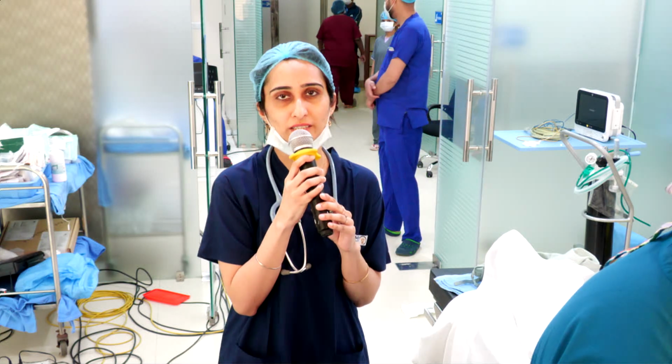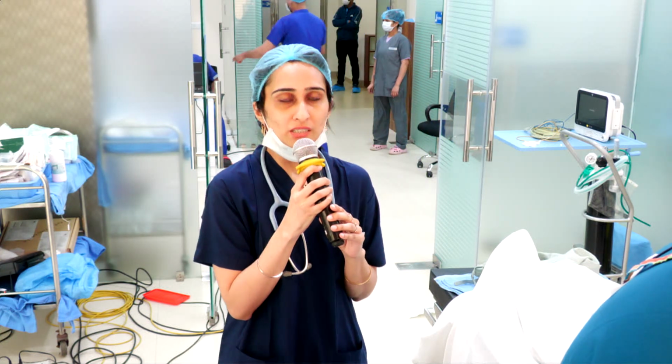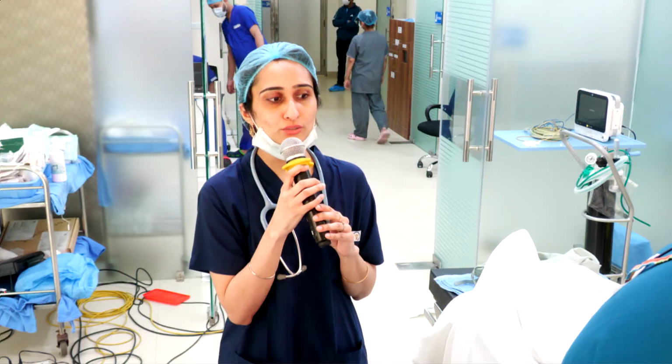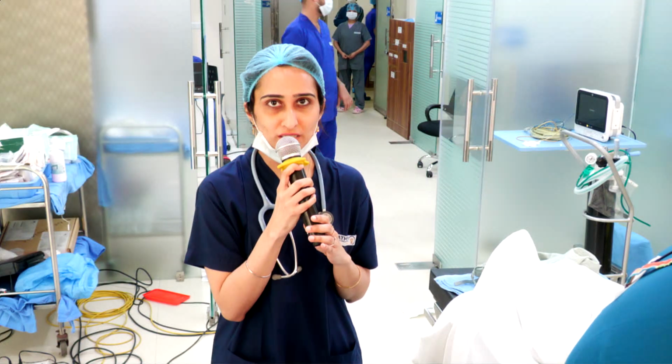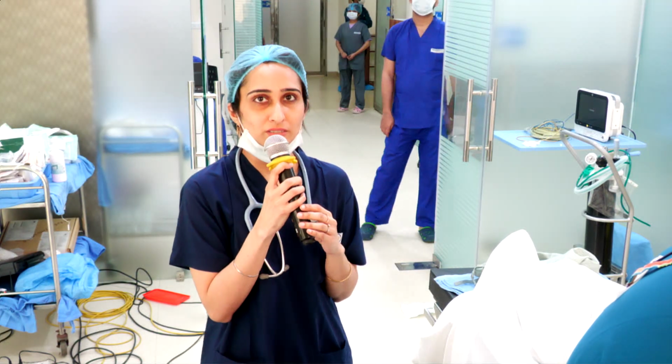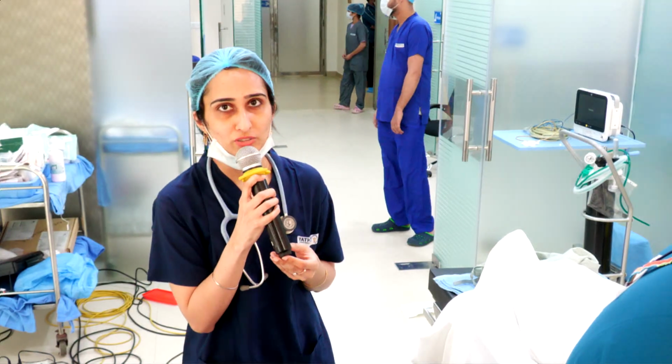He is an operated case of both bone forearm fracture. Ten nails were inserted. So today he's posted for implant removal. Dr. Sandeep Devan sir will be doing the suit scan, sequential ultrasound imaging technique for the brachial plexus, and he will demonstrate the supraclavicular block for this patient.